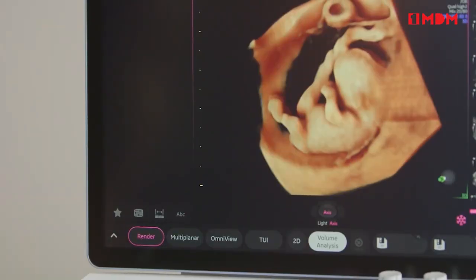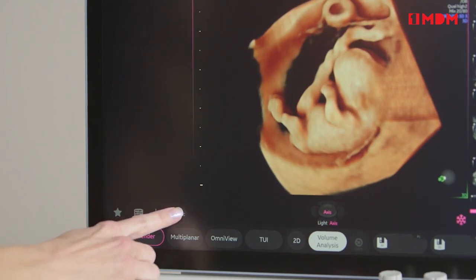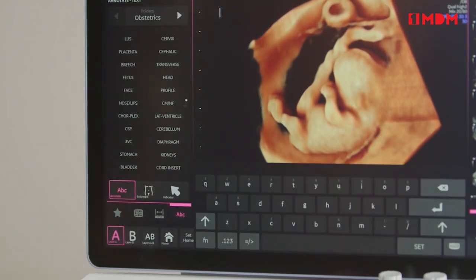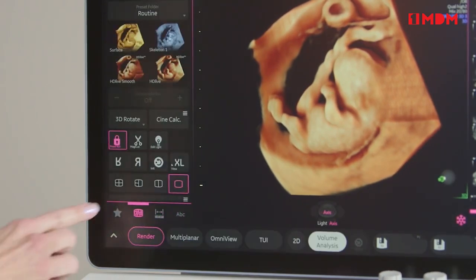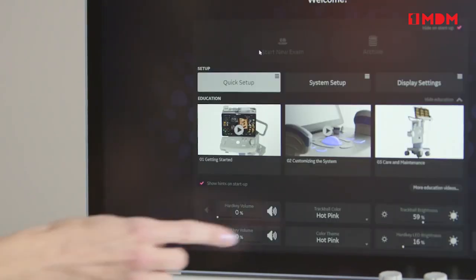With the highly customizable user interface, users can adapt their Swift to their personal annotations, measurements, imaging controls, favorites, and color scheme.